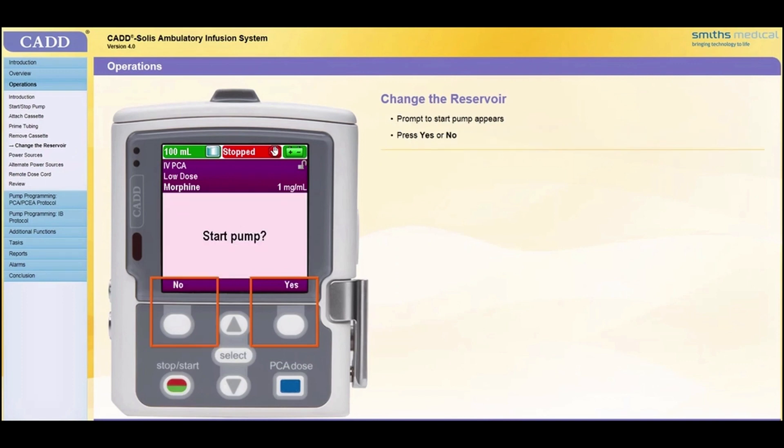Finally, a prompt to start the pump will appear. Press Yes or No as appropriate.